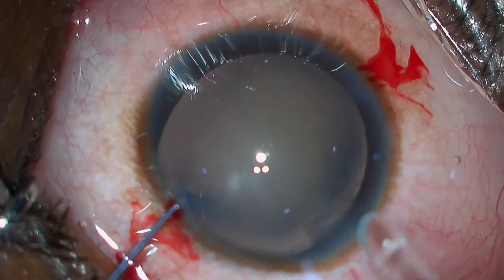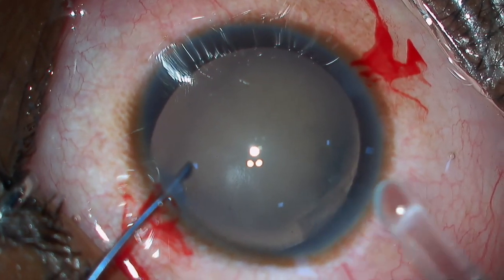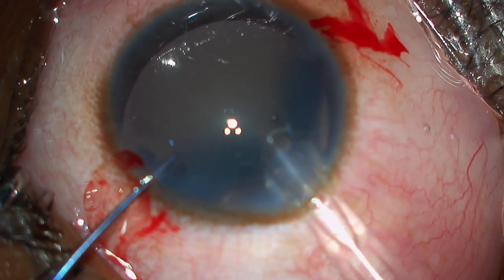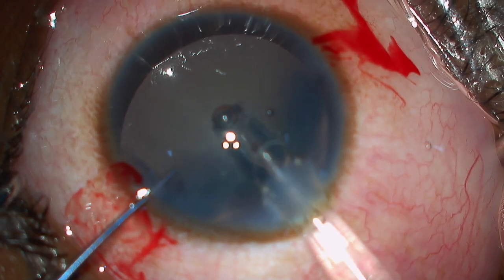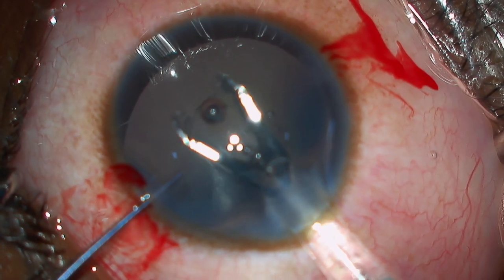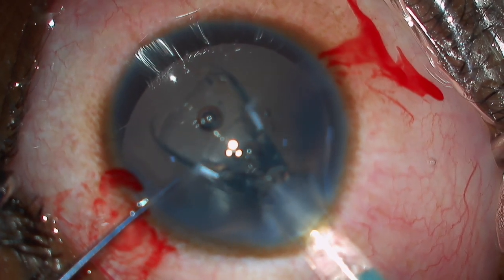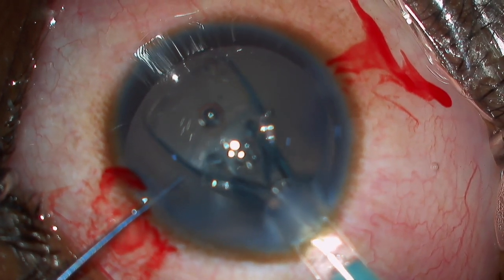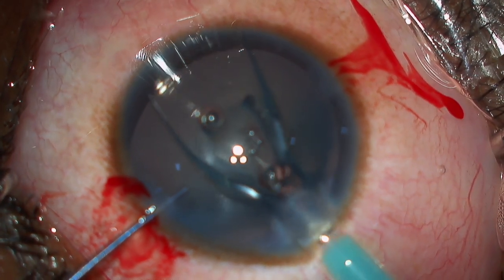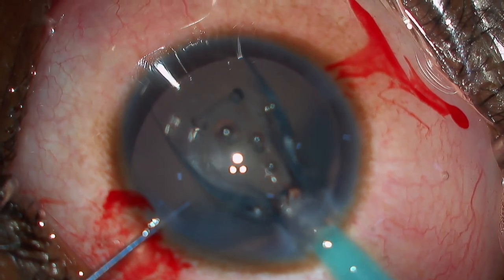After stabilizing the globe with the second instrument, we take the loaded lens cartridge into the 2.8 mm incision and start injecting. After injecting halfway through, I wait for the leading flaps to open like the wings of a butterfly, and then continue injecting to make sure that the lens does not flip inside the anterior chamber.